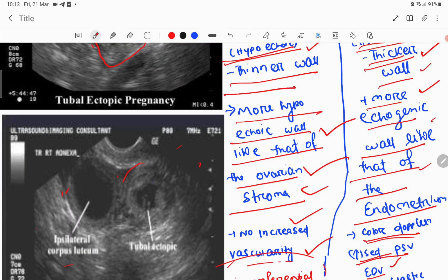The extra-ovarian structure is the tubal ectopic pregnancy. In contrast, ectopic pregnancy has a thicker wall. Inside the ectopic pregnancy you can see a fetal pole. The thicker wall is more echogenic. You can also see the ipsilateral corpus luteum, which has more hypoechoic walls compared to the ectopic mass.